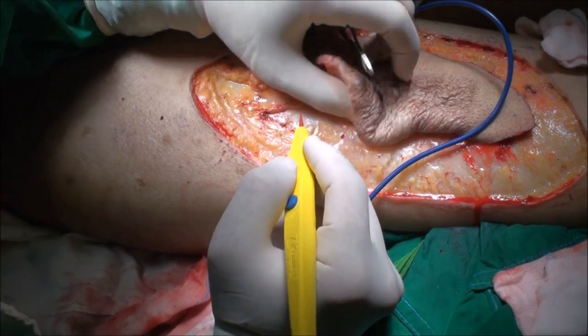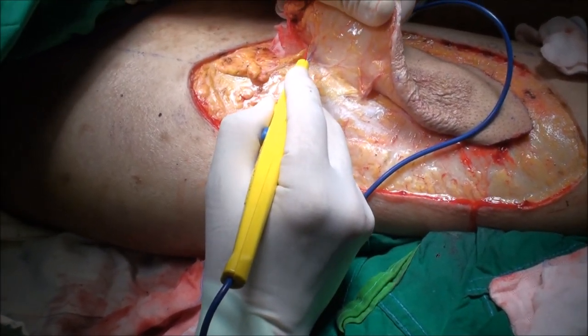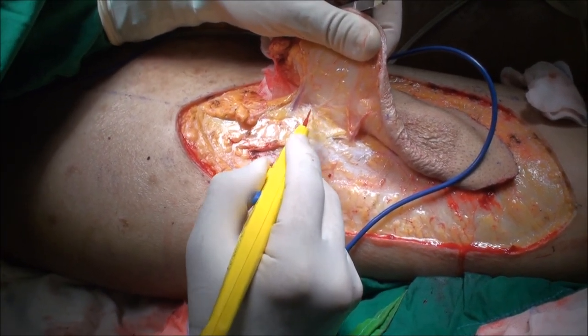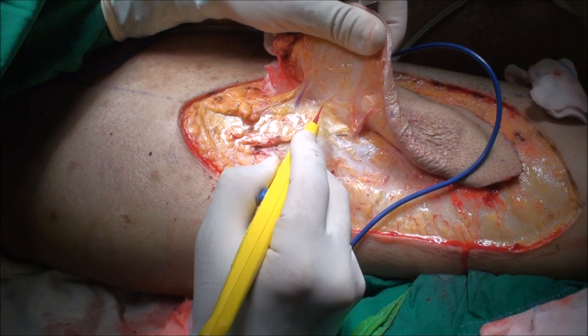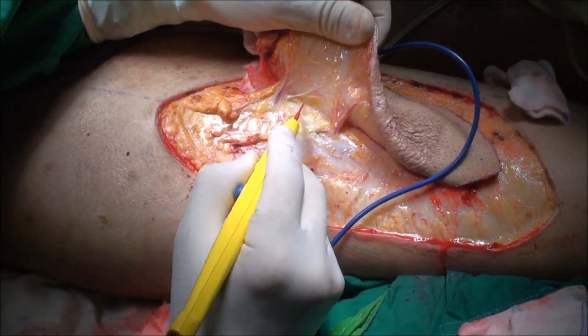Where the monopolar actually hits while dissecting the perforator. This perivascular structure is more evident in the perforators within the intramuscular portion. Now you can see that we are near the second perforator — we are fairly close, but again the target is that perivascular structure surrounding the perforator.